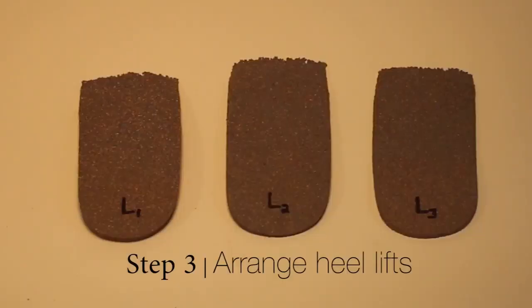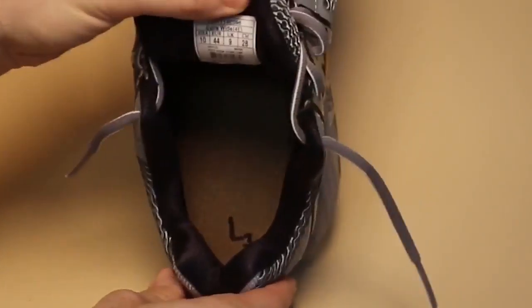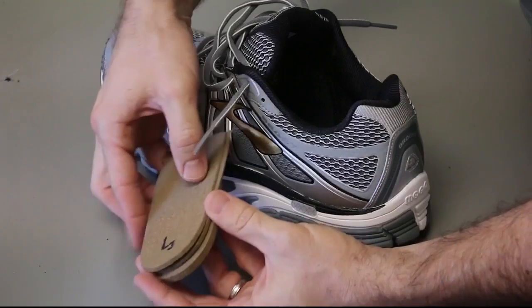Step 3. Like floors on a building, the lifts with the lowest number should be placed on the lowest tier. Insert the heel lift with the lowest number on the bottom. Often the limb length discrepancy is corrected using the extra lifts.